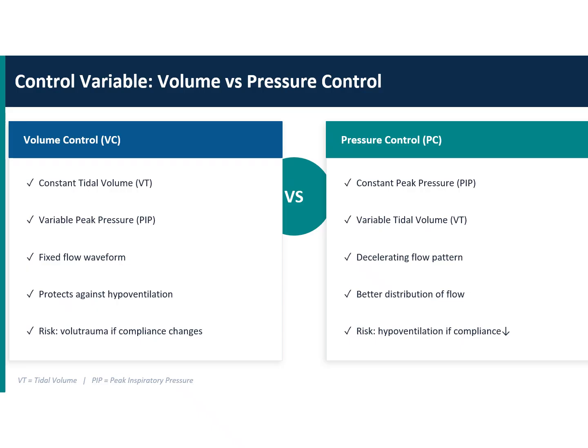In volume control ventilation, we put an alarm for pressure, so a peak pressure of around 40, or a low pressure of probably around 10, or whatever. So when you're delivering the 400 ml tidal volume you have set, the moment the pressure goes above 40, the flow will decrease to adjust to that pressure.